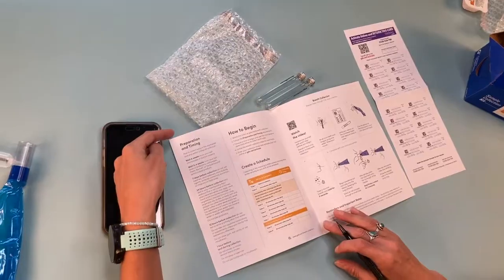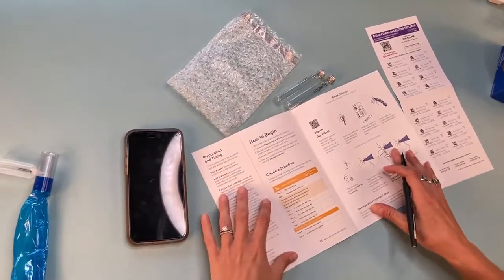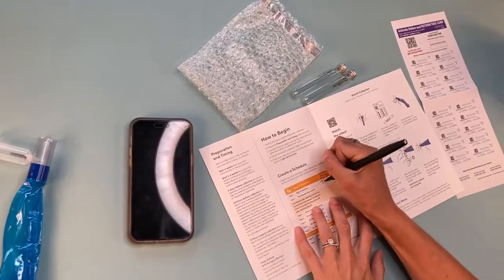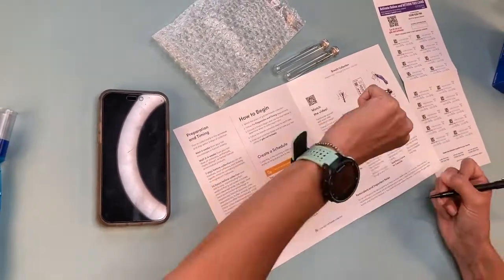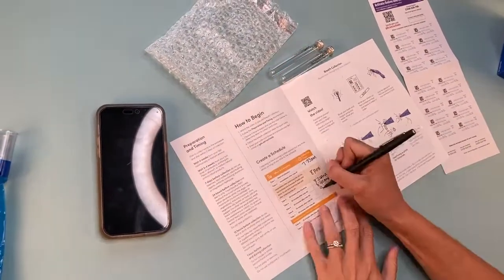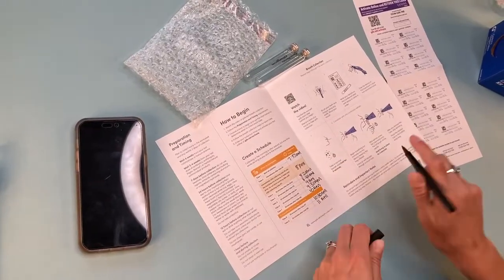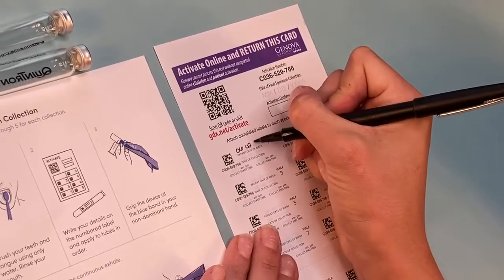Refer to the printed instructions found in your collection pack for preparation steps you must take before you begin your collection. Choose a time to begin and fill in the chart with the time you will collect each tube. Write your details on the numbered labels and apply to tubes in order.